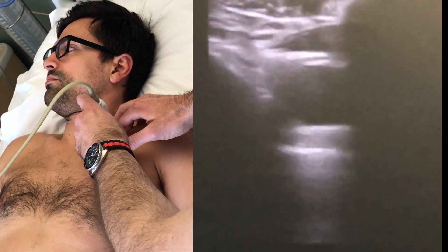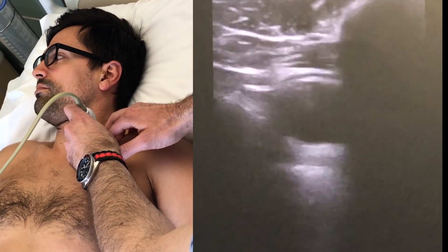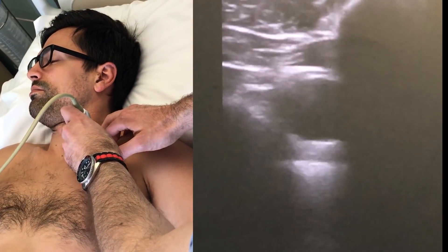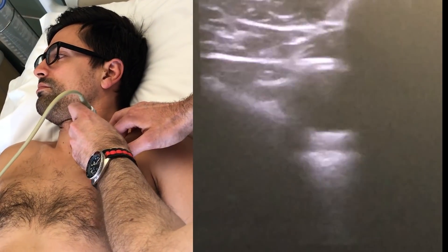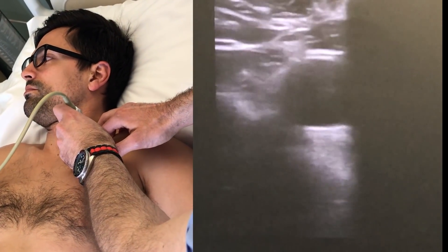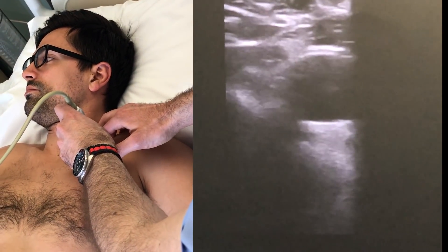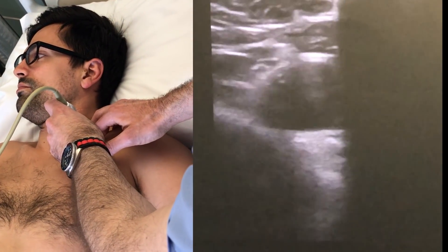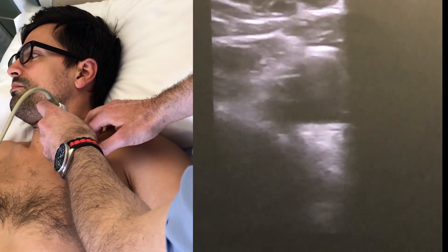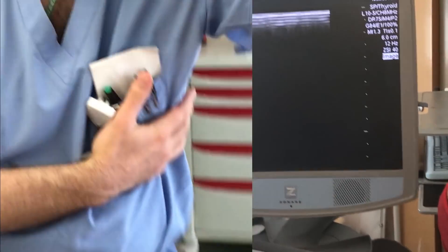Then we can do the fan technique where I'm kind of fanning a little bit. The target's moving back and forth a little bit so I can try to re-angle somewhat. Ideally you want it so that when you fan, the vein is staying mostly in the same place. Now when I'm fanning, the vein is kind of staying more or less in the center of the screen. This would probably be a reasonable place to cannulate the vein. We have a little real estate here, there's a bony target behind us, there's a valve there that proves this is a vein and not an artery.